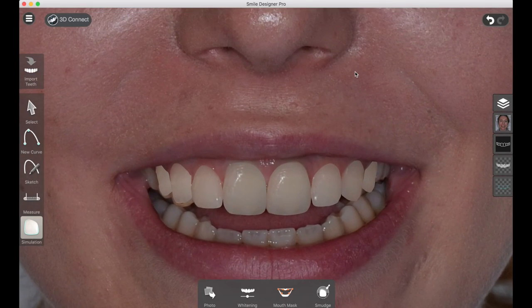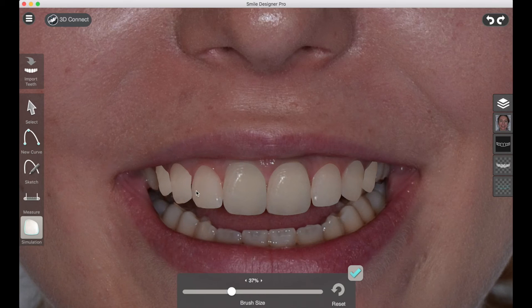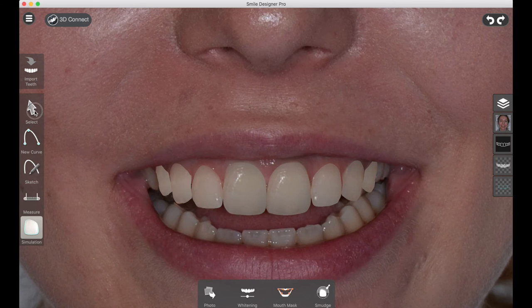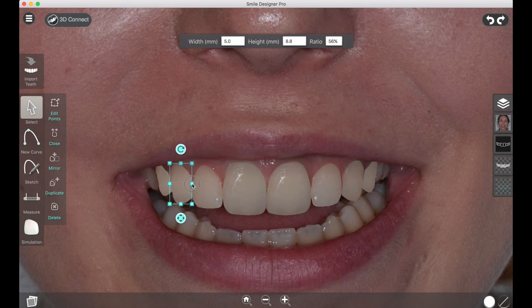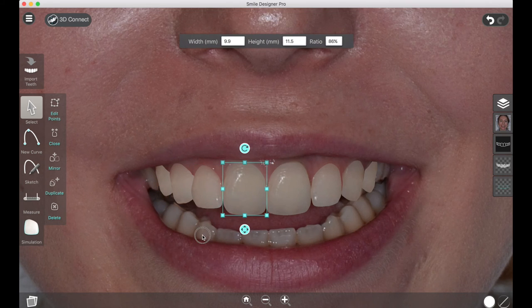Let's activate the smudge tool and do some quick smudges to shorten the teeth and get the patient's teeth out of the way. When you use the smudge tool, sometimes you'll see some gaps revealed between the teeth — that usually means there are gaps between the actual tooth contours you designed. You can go back to the select tool and drag these handles around to change the whole contour of the tooth, and that's looking much better.